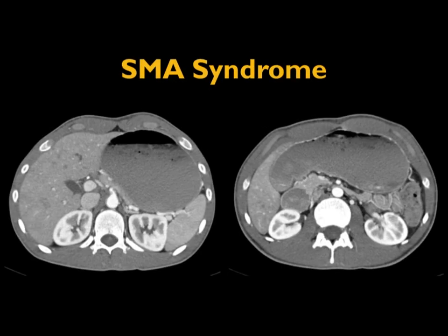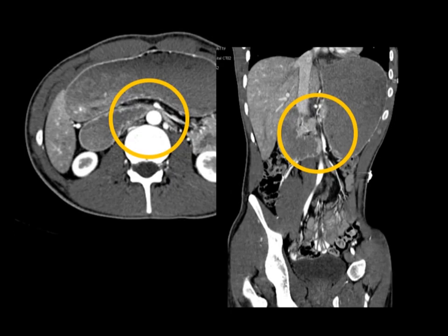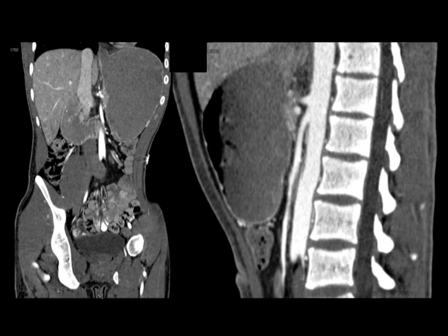An example: dilated stomach, dilated duodenum in an anorexic male patient. As the SMA comes across, the duodenum passes through the zone between the aorta and SMA — markedly narrowed and obstructed. On the coronal view, this is a classic example of SMA syndrome with obstruction. I should note: SMA angle narrowing can occur without symptoms. To call it SMA syndrome, you need to see duodenal obstruction. So if I see SMA angle narrowing on a scan, I'll comment on it, but unless the duodenum is dilated I won't call it SMA syndrome.